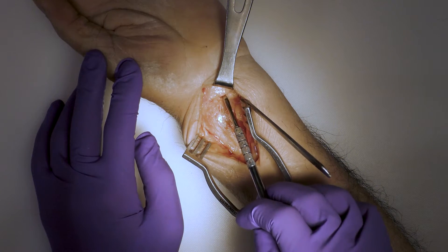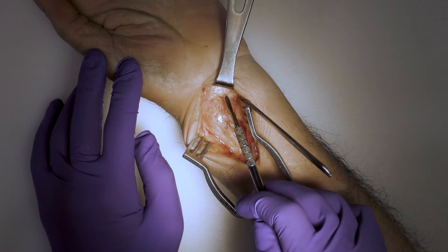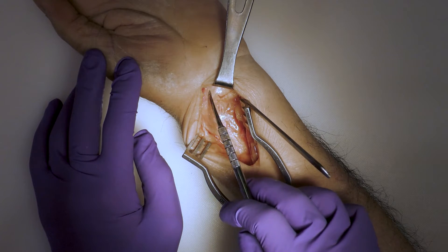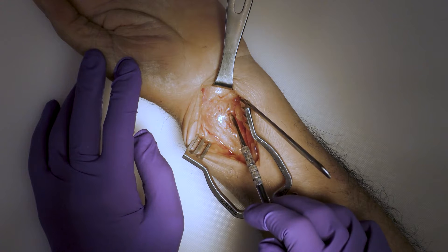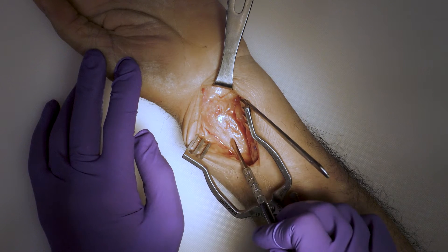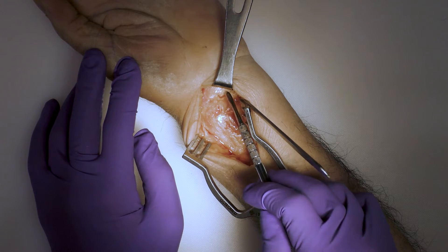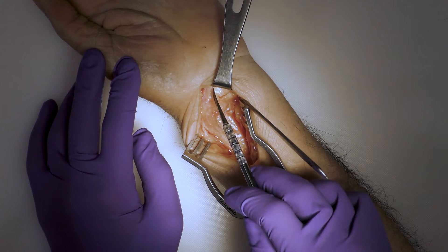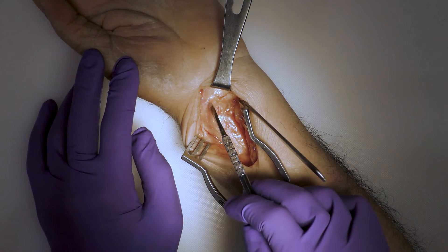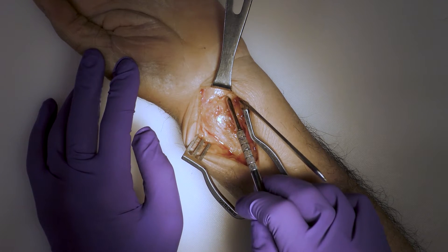To secure the volar ulnar corner fragment in conjunction with an AccuMed AccuLock 2 volar distal radius plate, place the avulsion hook plate first onto the fracture fragment, provisionally securing it to the distal radius, followed by placing an AccuLock 2 volar distal radius plate over top of that provisional fixation, fixing your plate to the rest of the distal radius, and then securing your screws through the plate. That is typically performed when you've obtained preoperative imaging and your surgeon comes in knowing this fragment is going to be of importance. In that case you can work with your scrub tech on the back table, getting prepared for the things you will need to achieve fixation with the avulsion hook plate and your AccuLock 2 volar distal radius plate.